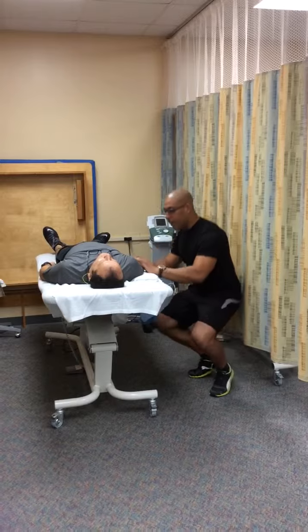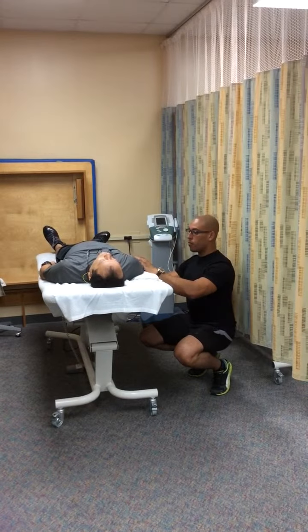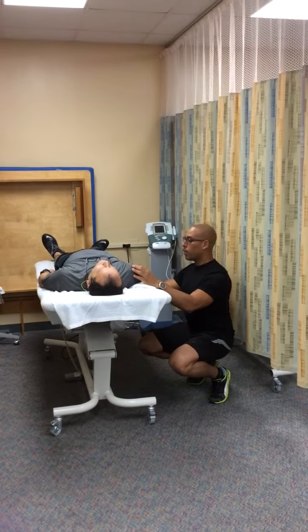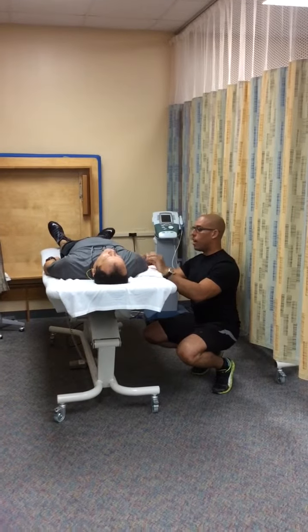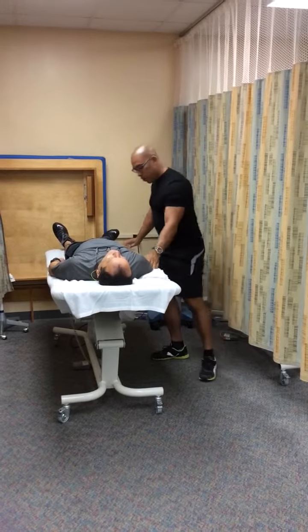I'm going to be at eye level for more accuracy. I'm going to read and record, then remove my goniometer.